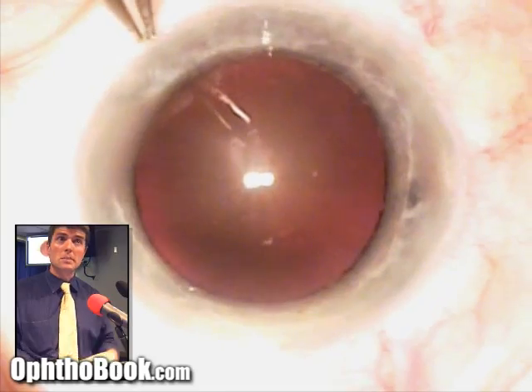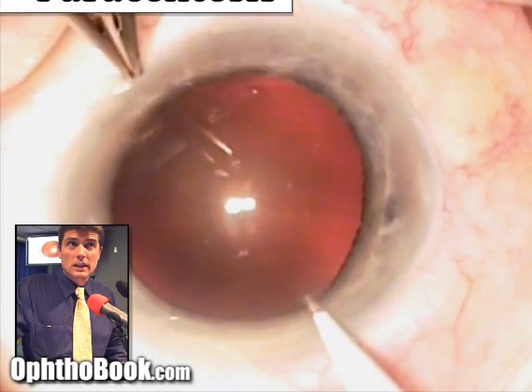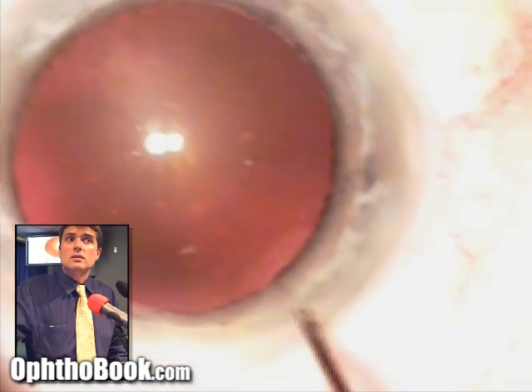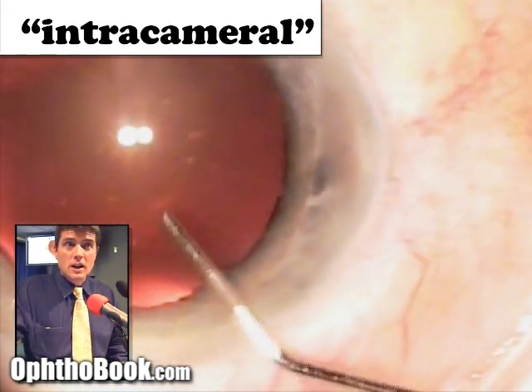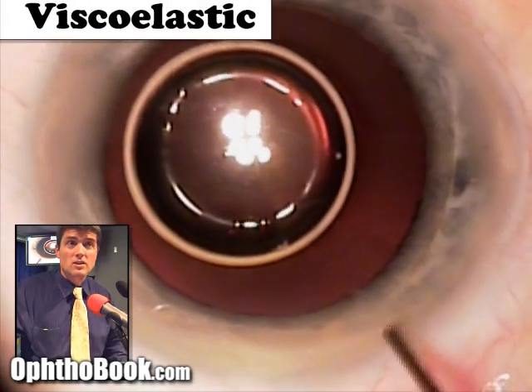Now let's watch a live surgery — I'll repeat all these steps. We start with our paracentesis, making that initial incision into the eye with the small knife, just like before, so we can inject all our instruments and solutions. Then we inject lidocaine into the eye to numb up the iris — it's very sensitive being a muscle. There were some air bubbles in there which we'll clear out, but they'll actually help us see the next step better.